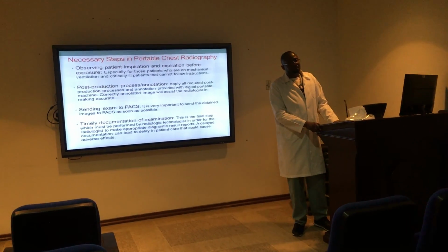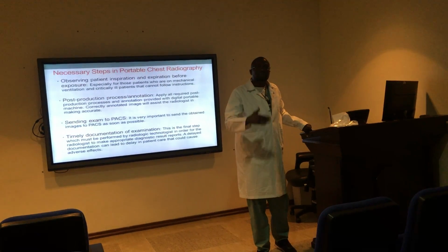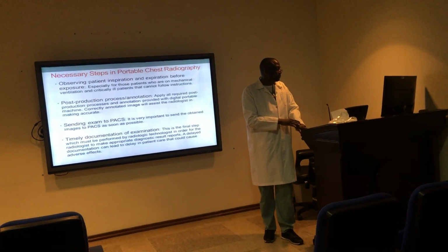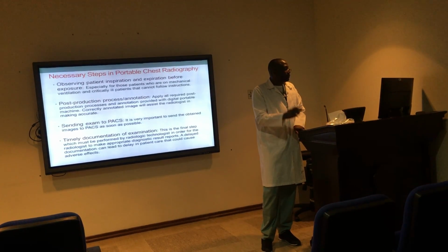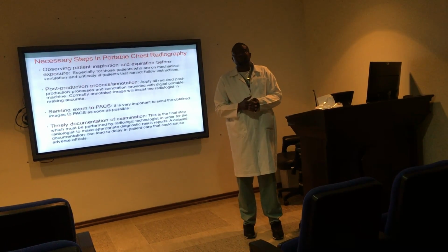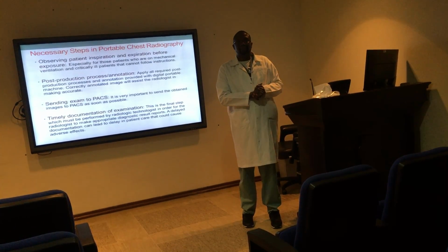After doing this, now the image exam has to be sent to the system, PACS, Picture Archive. If you perform an exam, you don't send it to PACS, the exam image will remain on the machine.